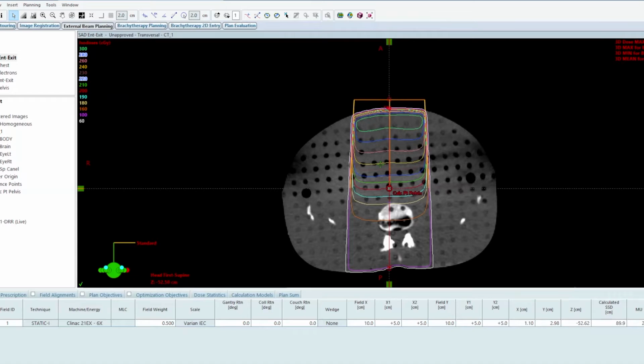However, with SAD technique, it's different because TMR, TPR, TAR don't have that inverse square component factored into them, because it's relative. It's relative at two different depths with the same source to axis distance. So it's only the attenuation that's being taken into account.